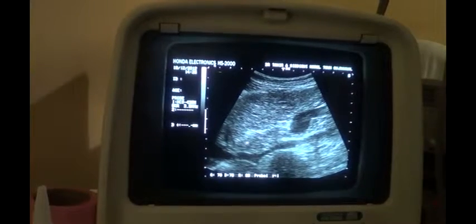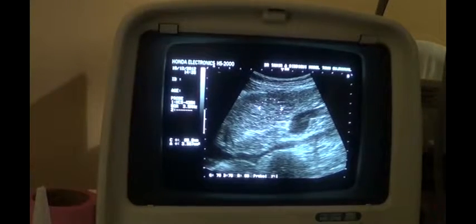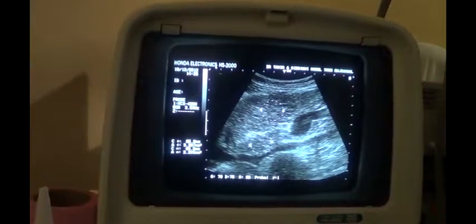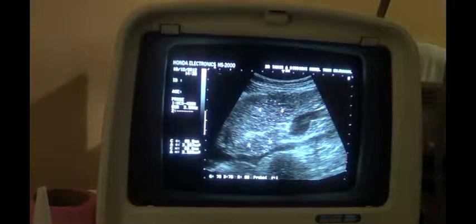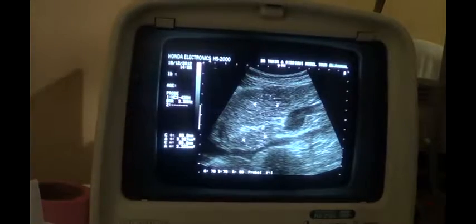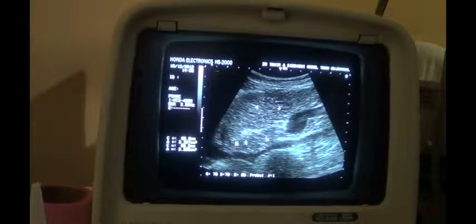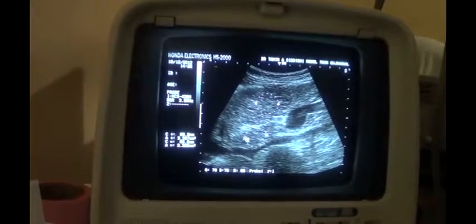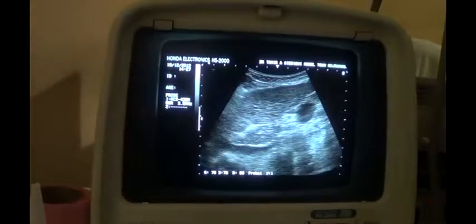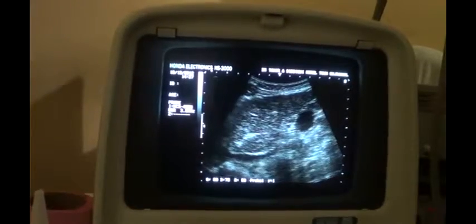And you see that if we compare the echogenicity of the caudate lobe, this is the caudate lobe or segment 1 of the liver, they are almost the same. Whereas in most cases, in 90% of cases, you will see that the echogenicity of the caudate lobe or segment 1 will be preserved, because this segment of the liver contains its own separate blood supply. So in this case, we see that the caudate lobe is also involved in the cirrhotic process.